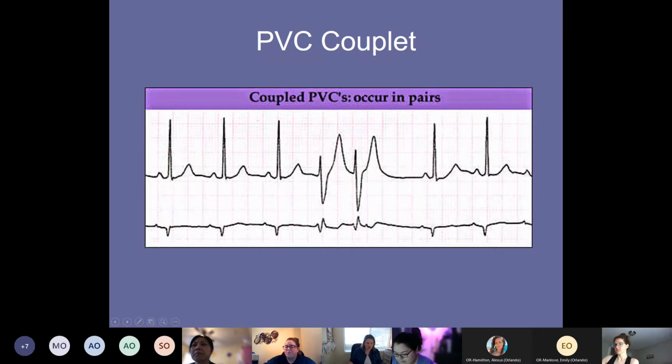So when we talk about critical thinking and looking at your patient, if you're seeing a PVC, you should be thinking, oh, how are their electrolytes? How is their oxygen? What's going on there? And then if you start seeing multifocal PVCs, that's worse. Okay, that means you have more than one cell that's getting irritated. If you see them moving from every fourth to every third, it's getting worse. Once you start seeing a couplet together, two in a row, that should be a warning sign. I'm heading toward VTAC here. Actually, your patient's heading toward VTAC here. This is a warning sign. Don't let this go unnoticed.